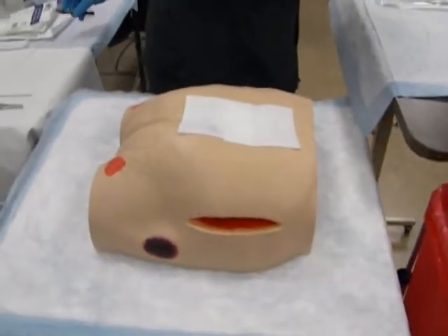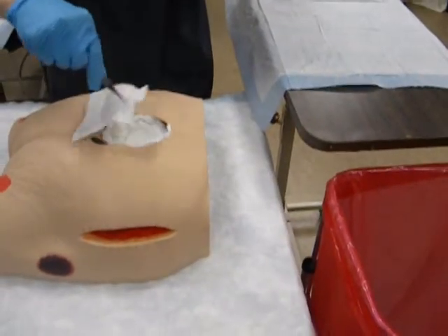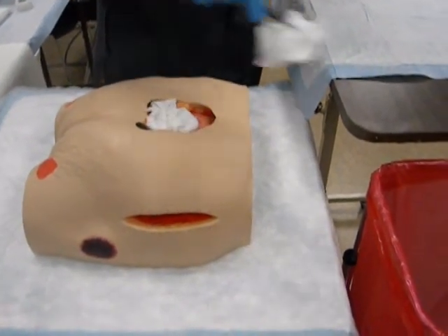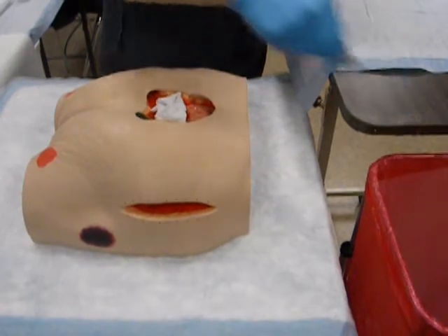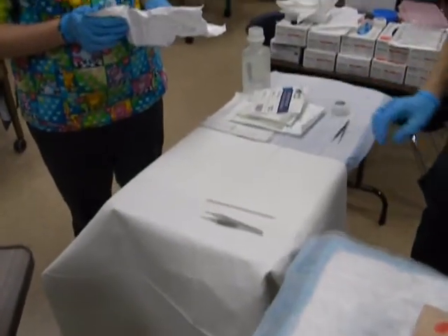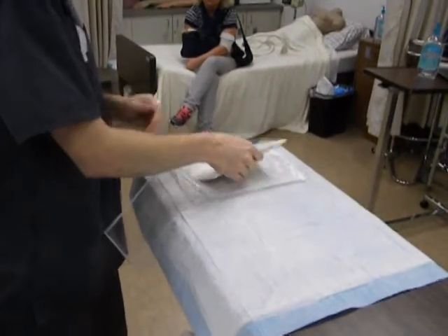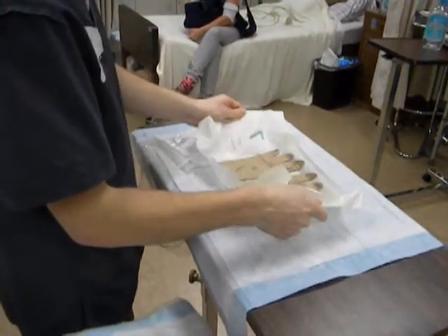All of the dressings that are currently being removed from the patient will go into an appropriate biohazard receptacle. When you are removing the old dressing, you want to be cautious that you may be debriding some of the base of the wound, so careful removal is essential. Once the old dressing is removed, you're going to begin the process of assessing your patient's wound. We will put on sterile gloves before we go back at that pressure ulcer to make our assessment.